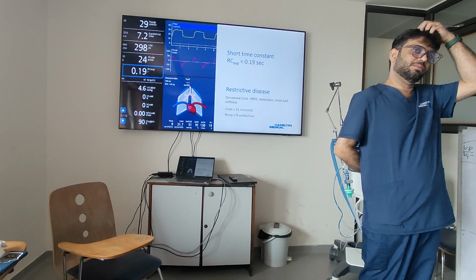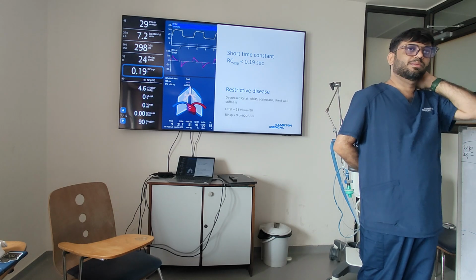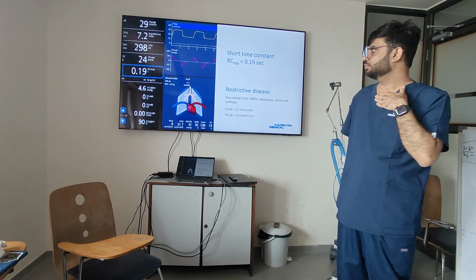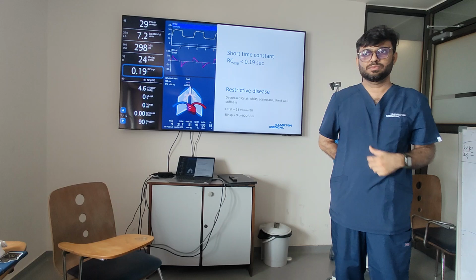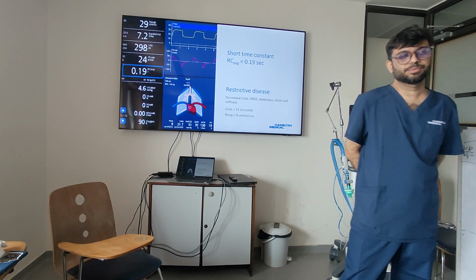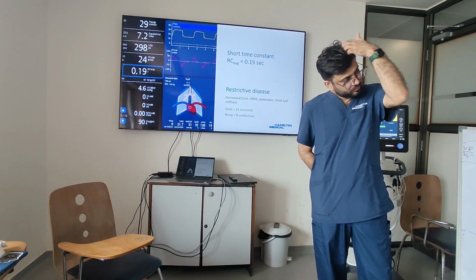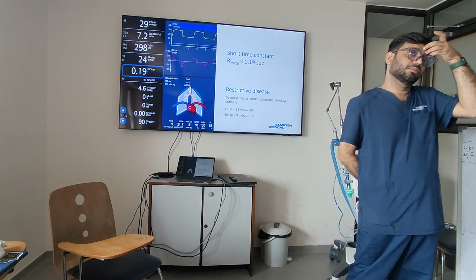If the patient gets hyperthermic, he will produce more carbon dioxide. He will wash out more carbon dioxide. So if he's going to do that, you have to increase this. So if the VTE is more than 1000, it will not go like that. It will go only if there is an extreme change in the condition which will cause it. That's why I'm saying, when the patient is very sick or very different, don't try to do this. That means the patient is sick. You need to treat that patient.